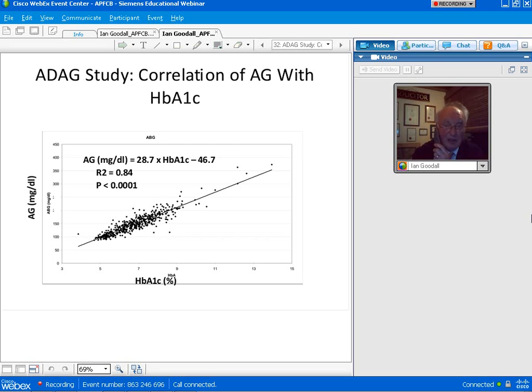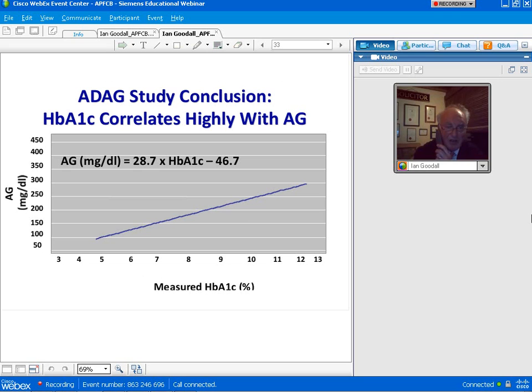The original study success was predetermined before they did any work on this. The definition of success was that 90% of the cohort values fell in this range, which is plus or minus 15%. So you get this enormous scatter. But in fact, when you look at the hemoglobin A1C values, there are very few values actually above 9%, so there were not many with really severe diabetes.